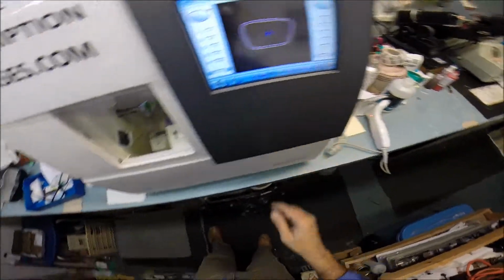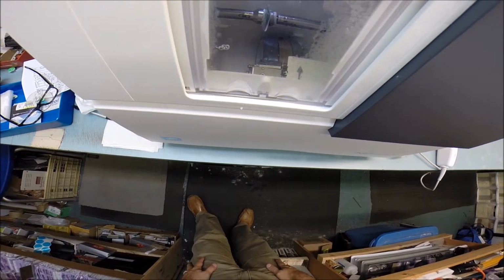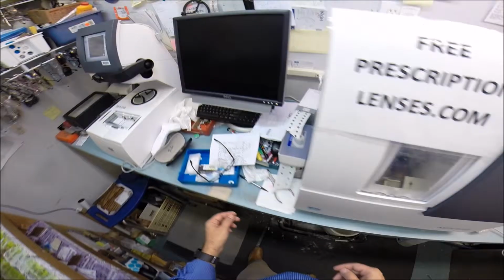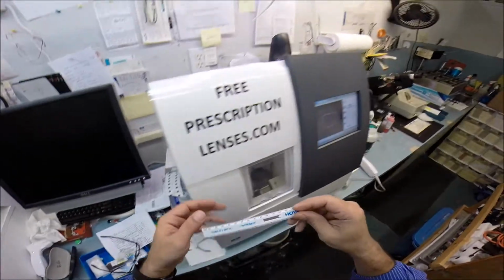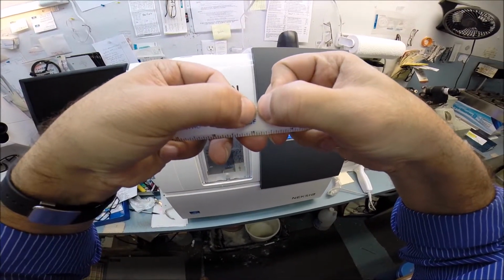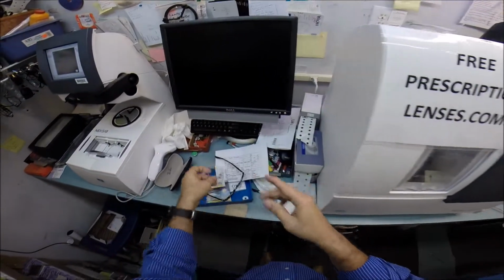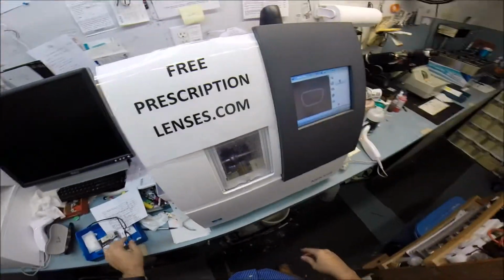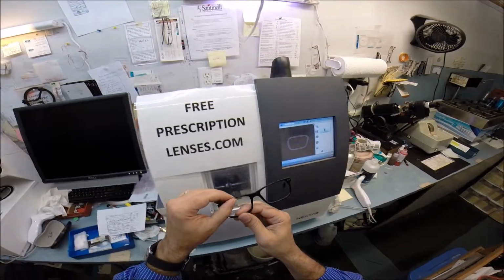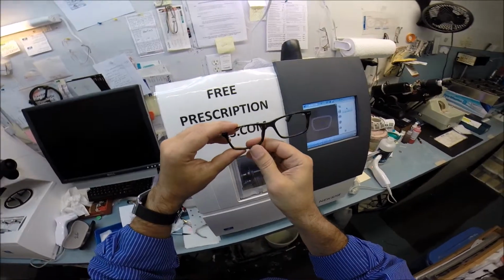Hit the retouch button. The door will close, the clamp will shut, and instead of going to the cutting wheel, it's just going to go to the bevel wheel and take 1/10 of a millimeter off. And for everyone at home who doesn't know what a millimeter is, it is the distance between my thumbnails. I'm going to take 1/10 of that distance off all the way around the circumference of your lens until it snaps into your frame easily. I do not want to force the frame in there, because it would cause your frame to stretch, or worse, what we call roll.